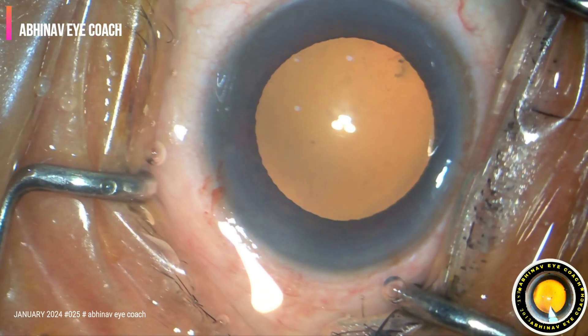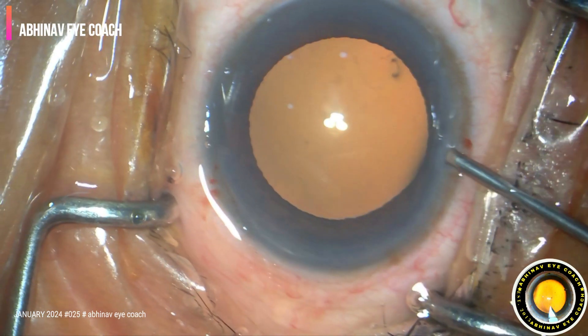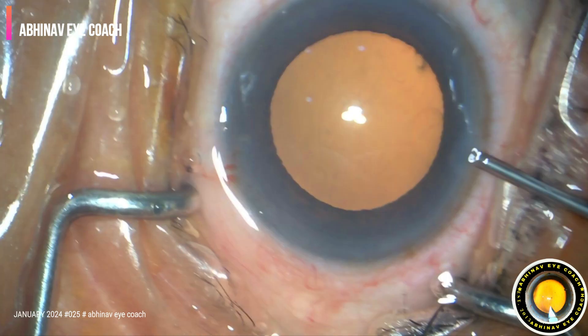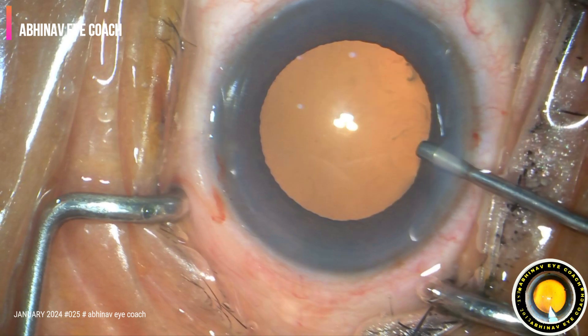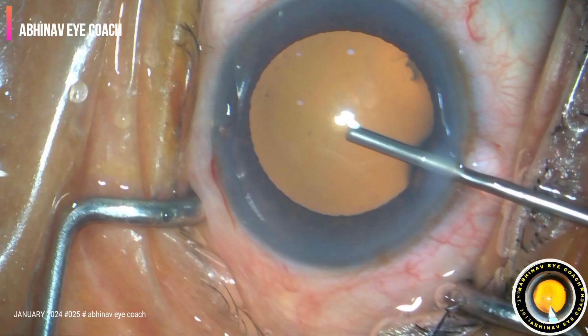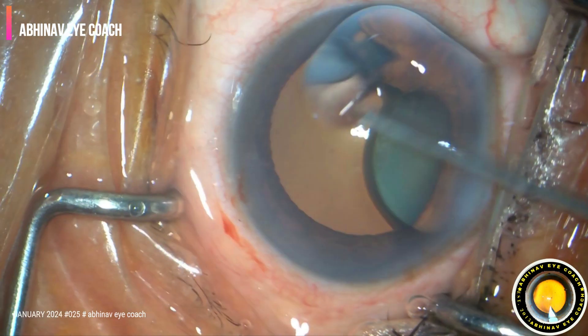Anterior chamber is filled with intracameral lignocaine and dispersive viscoelastic. The cannula is reduced to the other end, then gradually we inject slowly.